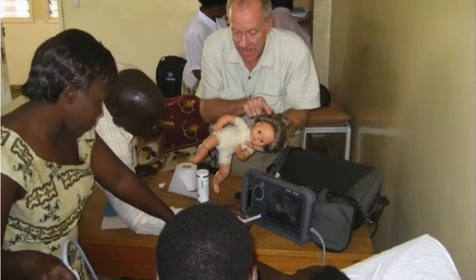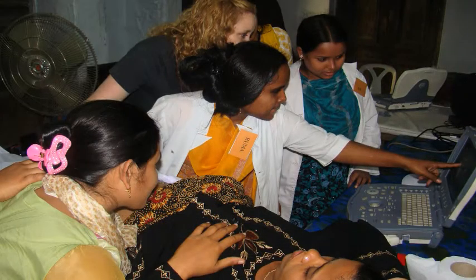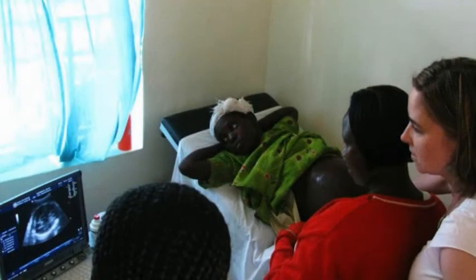You will also learn to identify conditions that you may not find on a physical exam alone. Ultrasound measurements are important to all aspects of your work and they will be covered in more detail during the live training. Knowing how to make ultrasound measurements and assessing patients will make labor and delivery safer for the mother and the baby. Let's begin by taking a look at the ultrasound machine and how ultrasound works.